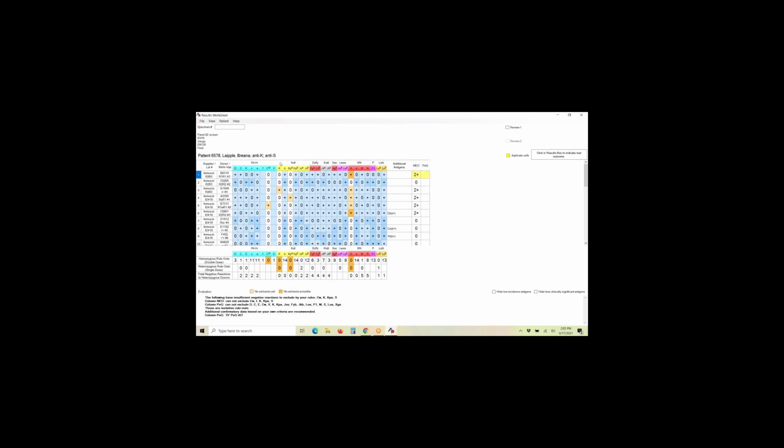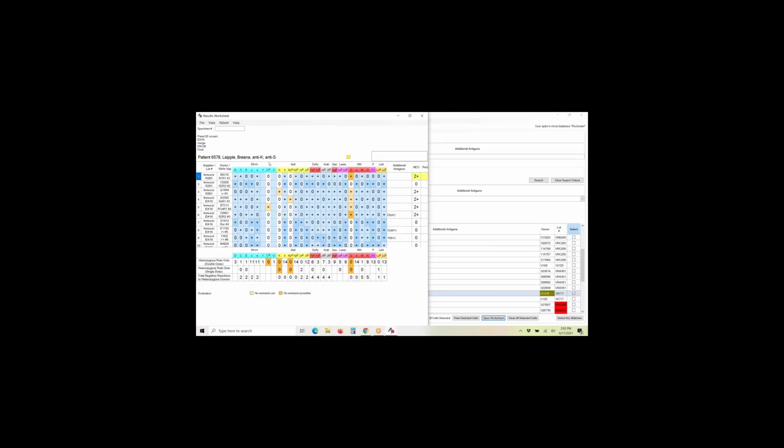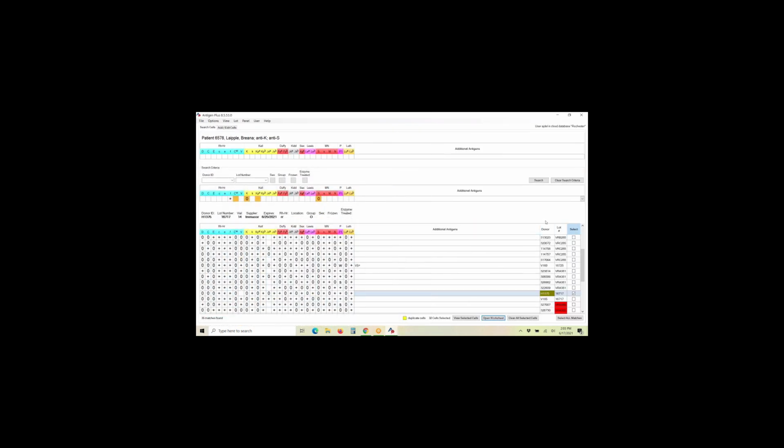And if you go to the page and get that patient back in, even if they're not reactive to those anymore, you still have the history to tell you not to transfuse. So there you go. You could just check by, this is what would show up when you just checked for the patient, and it'll have the antibody right there. And then when you're finished with your patient, you just clear out your search criteria, and you're ready to start over.